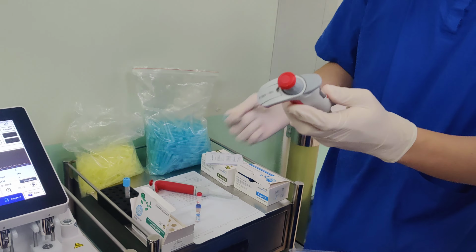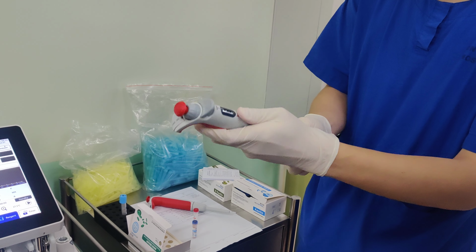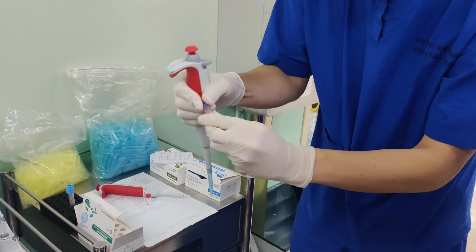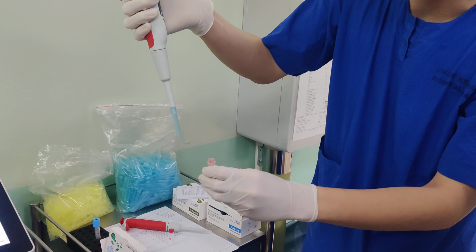Now we are using a different mixture. So every time you change the sample, you must change the tip. Okay, so now 340, this is the step, transfer it into the cup holder. This is the final step. Okay, same. First stop, you see?